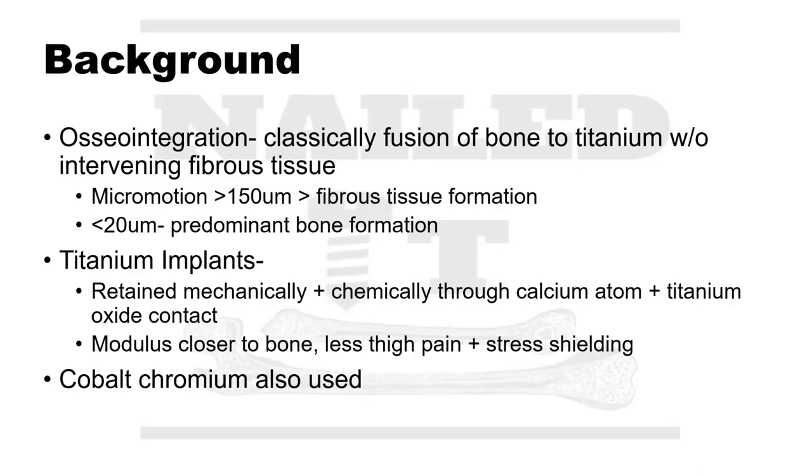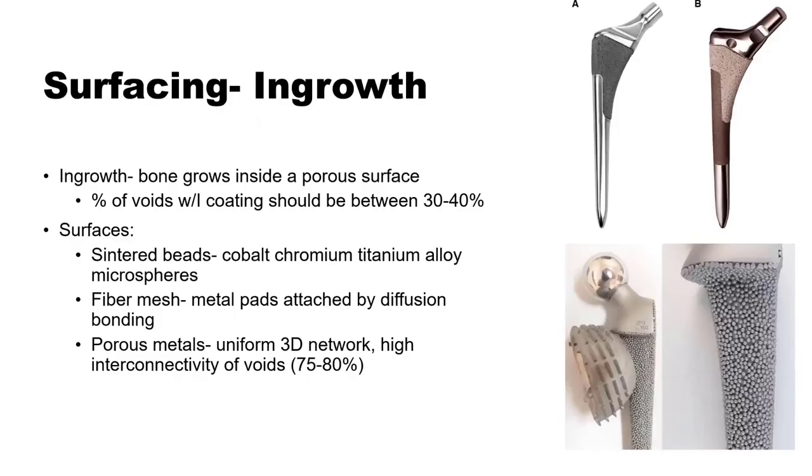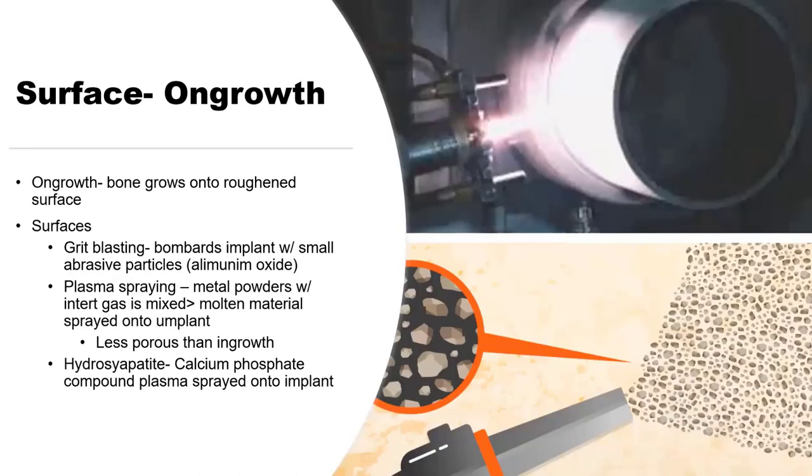Okay. And can we dive a little bit deeper into that? What is the difference between ingrowth and ongrowth when we're talking about the surfacing of these different implants? Right. So ingrowth is where you have a porous surface, whether it's mesh or beads or something like that, and the bone grows into that coating. And ongrowth is where you have some kind of coated surface, grit blasted, plasma sprayed, and the bone grows on top of it.